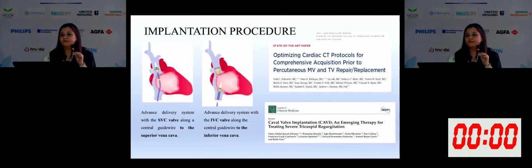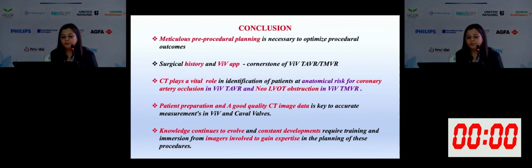These are two articles if anyone wants to read further on the bicaval valves. I conclude by saying that meticulous pre-procedure planning is very, very important in intervention cases. And proper history for the valve and valve-in-valve apps are very useful.